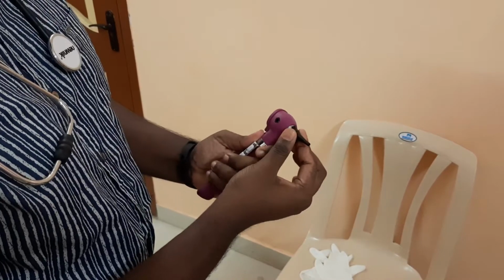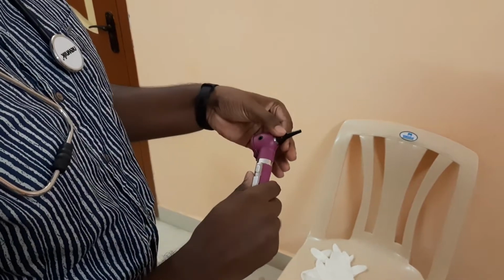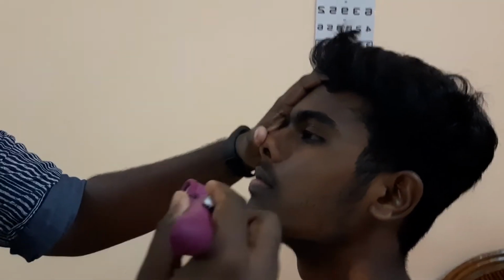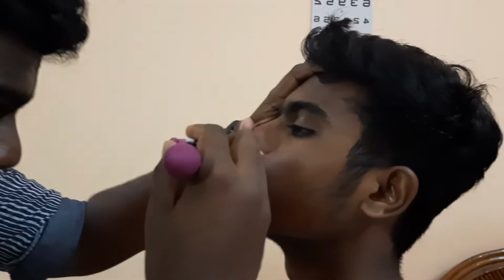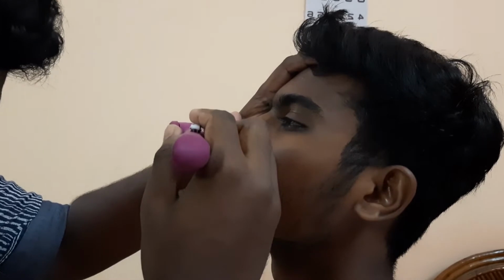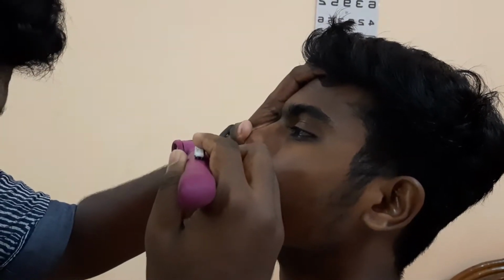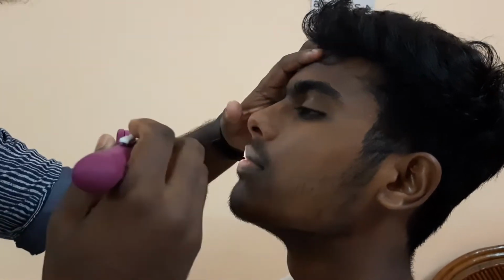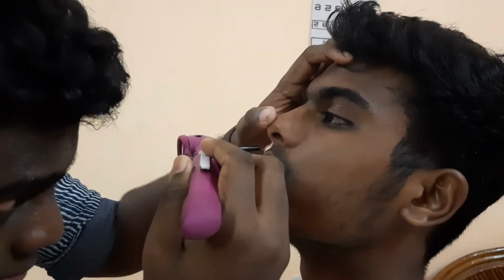I am using the largest speculum available to inspect the inside of the nasal passages. I am inserting the otoscope gently and making sure not to touch the sensitive nasal septum. I will repeat the same procedure on the other side of the nose. I am noting the color and condition of the nasal mucosa. The nasal mucosa is normal, with no swelling, exudates, or bleeding.